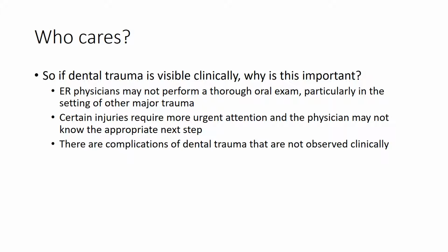Also, even if the injury is noticed by the clinician, radiology may help guide the physician in taking the appropriate next clinical step, which may be a referral to a dentist or oral surgeon. And finally, there are complications of dental trauma that are not visible clinically, but are readily seen radiographically.